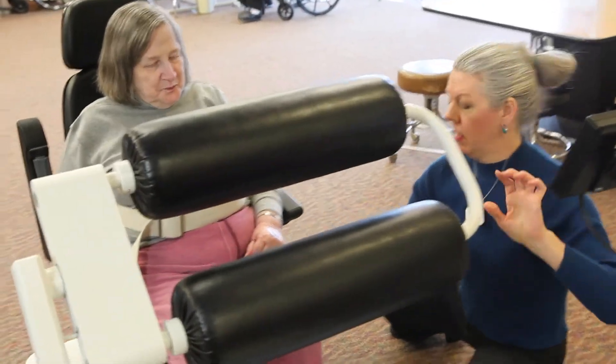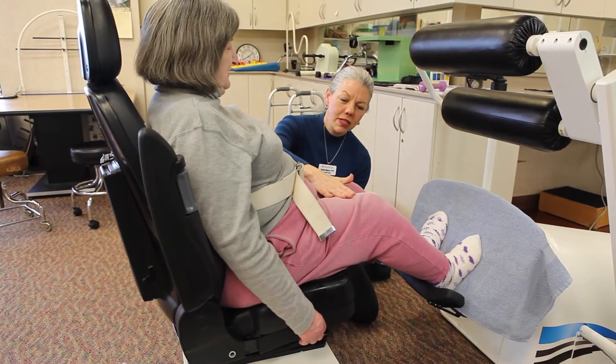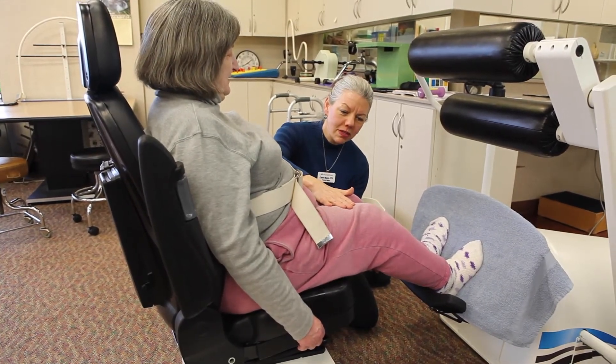It's been a really good fit, and the comfort level for them psychologically — because they're sitting and they're not worried about falling — is really good for increasing the weight bearing piece that is critical for getting them back into functioning.